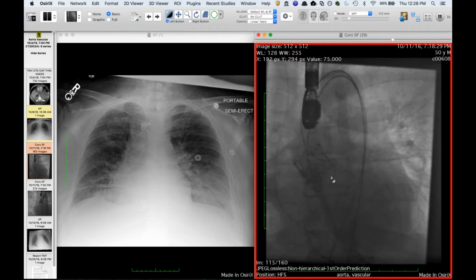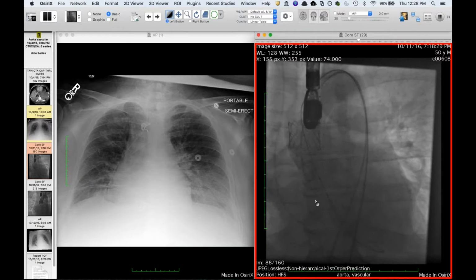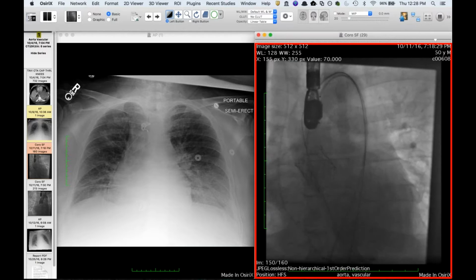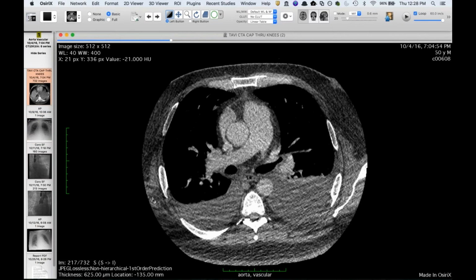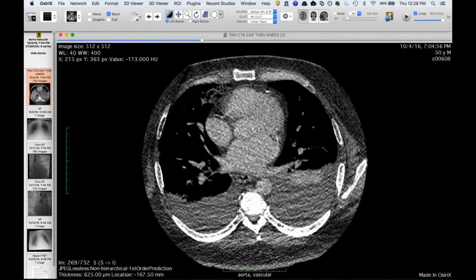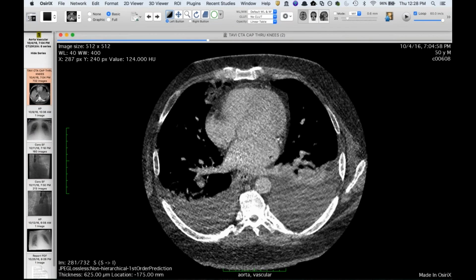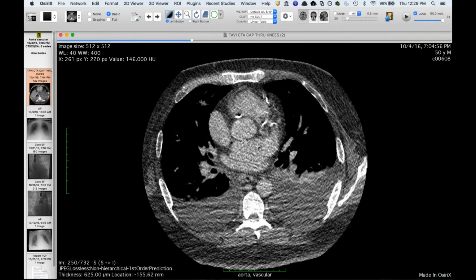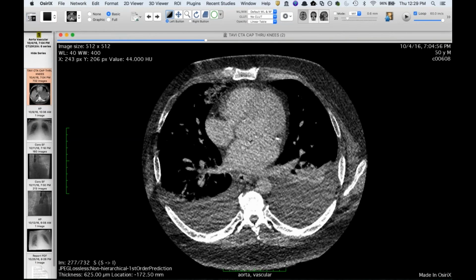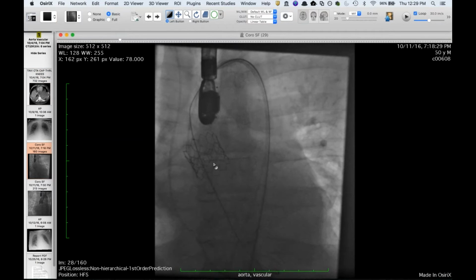So again, my theme of the day with these fluoro images, just showing how this was inflated and expanded, but it wasn't well seated in the valve. And I think part of that is we're used to seeing these more in patients that have a calcified, solidified aortic annulus. And this guy is young, and he's a really large guy too. It's a noisy study, but there wasn't as much purchase there because there's no calcification. And also it's probably that it was friable because he had endocarditis as well. But I thought it was just an interesting fluoro image of that.